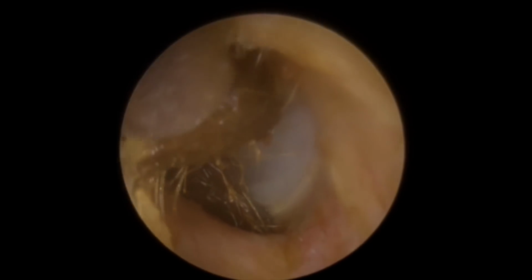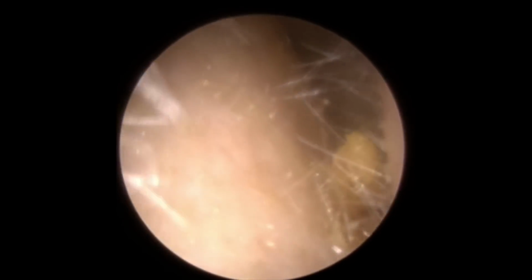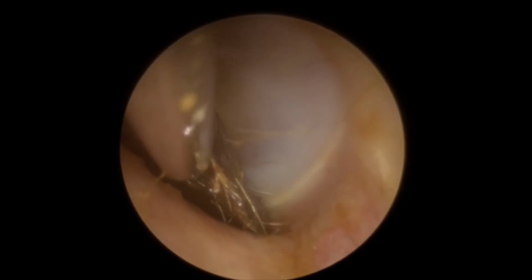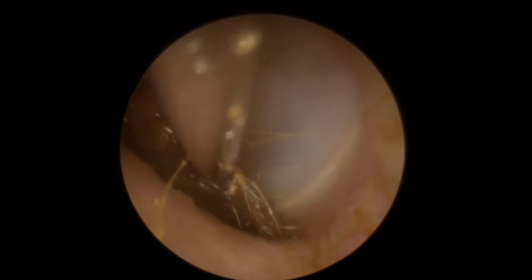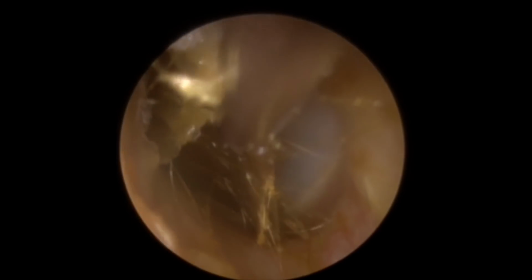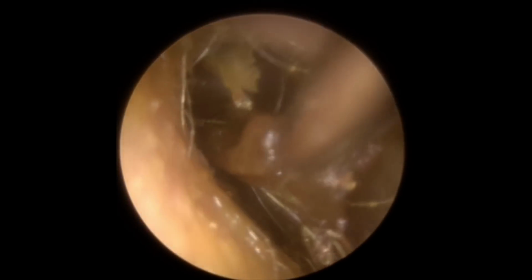There we go. See, that's the top section of the wax now coming away. That was the piece that was jutting out towards the front of the canal. Just got to aim for this back section now, the section closest to the eardrum. So I'm going to aim quite low to pull it out of that groove just in front of the eardrum there. There we go. And out, it's all starting to move. Got to reposition now. There we go, just folding the top section down. There we are. It's on its way.